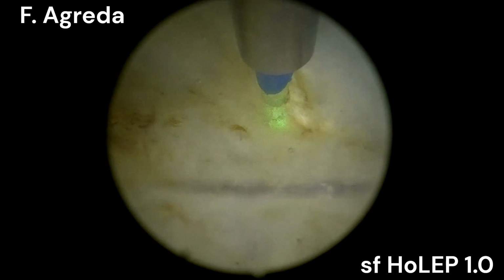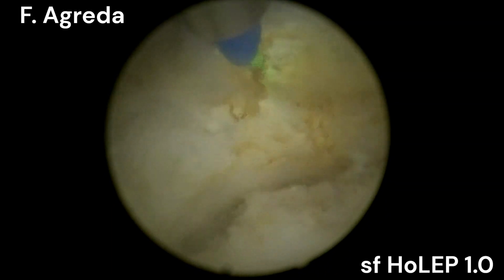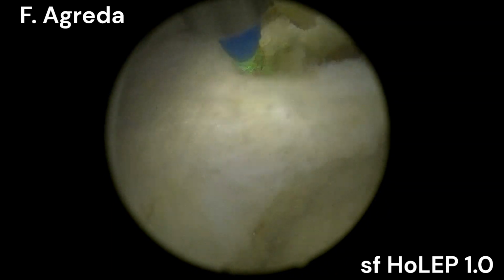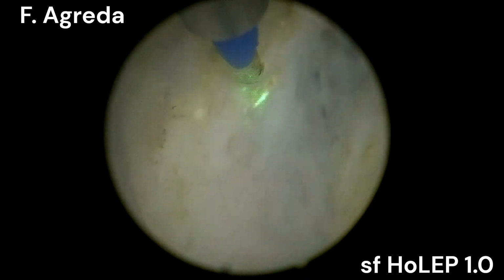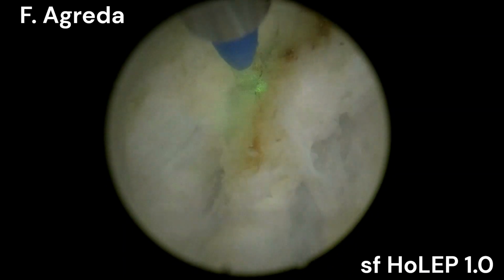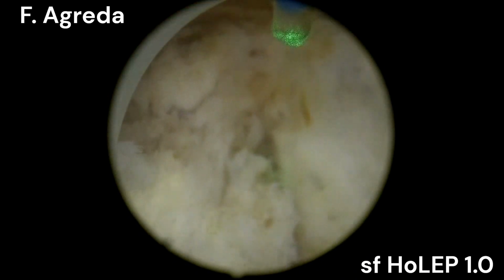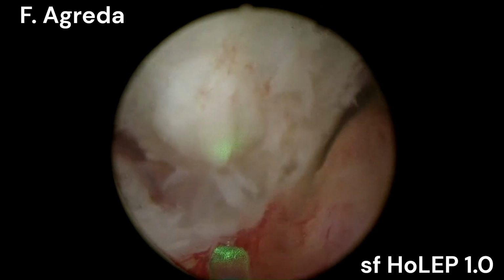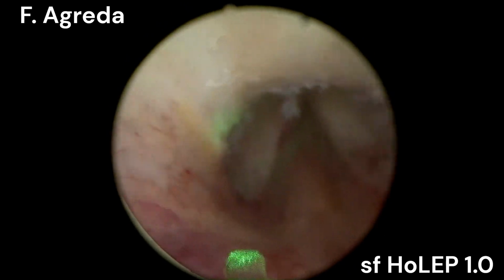In the sphincter first HoLEP, the last part of the dissection goes through the verumontanum. We usually go anterior first to dissect the sphincteric mucosa and the external sphincter, and then we dissect both lateral lobes, and we progress anteriorly till we get to the bladder. I will show you here. This is the sphincteric mucosa completely intact.